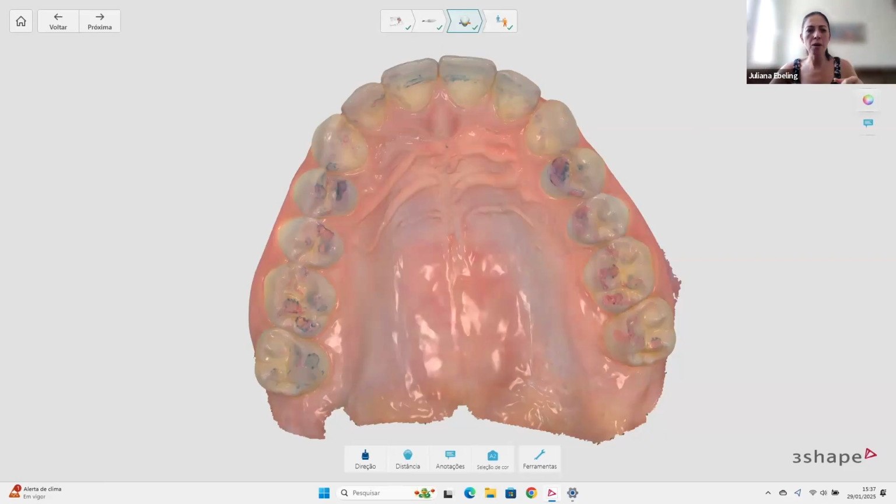But if I put four pins under it, I need much less effort to move this box. So the kind of surface contact is very important.